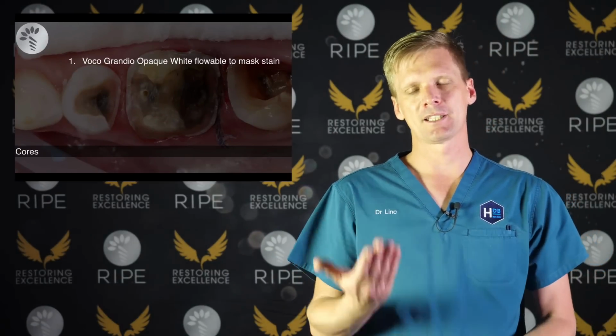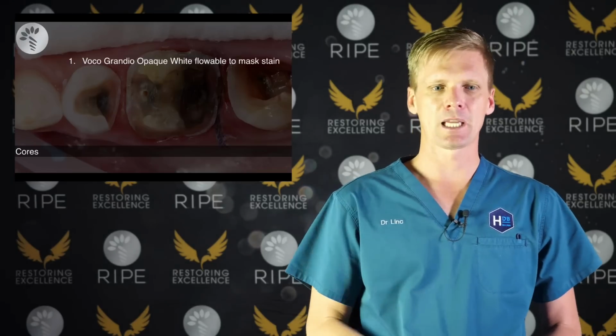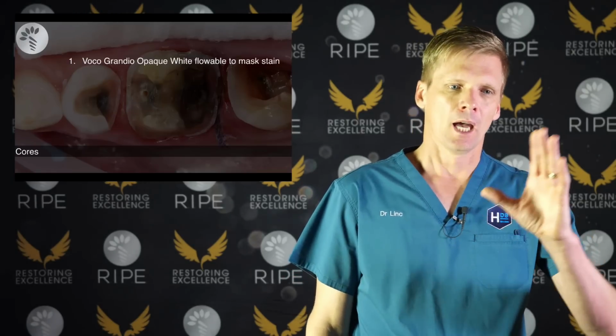And so I don't want that black stain coming through. I have had crowns where you get the grey shadow in the middle of the fissure because the black stain was coming up through the core. I'm going to cure that.